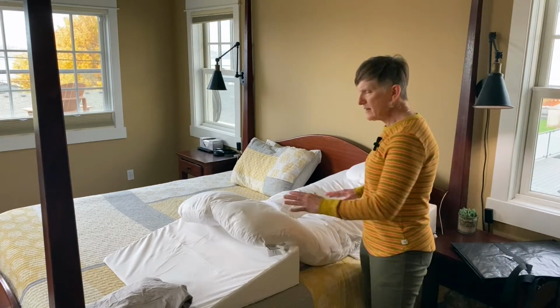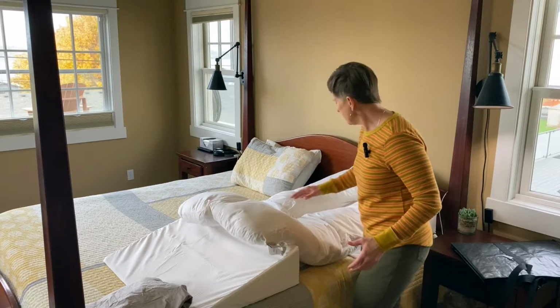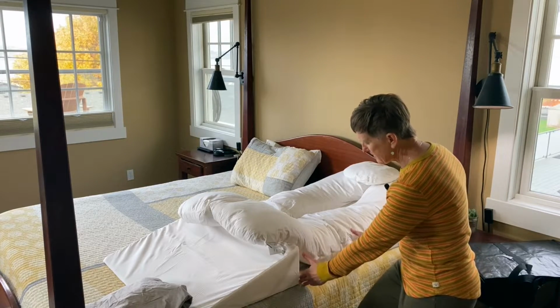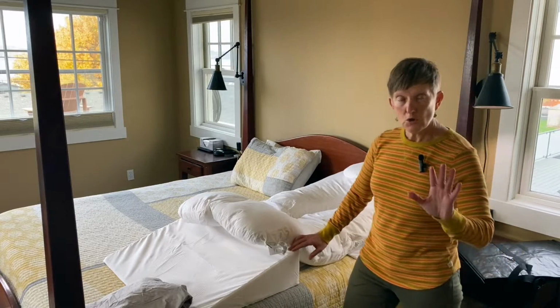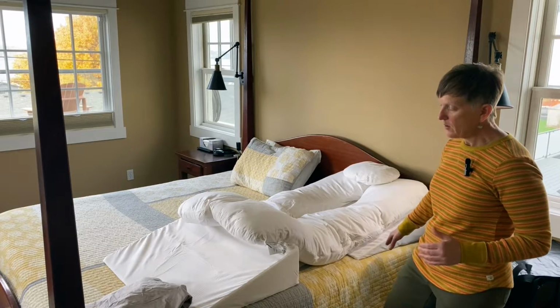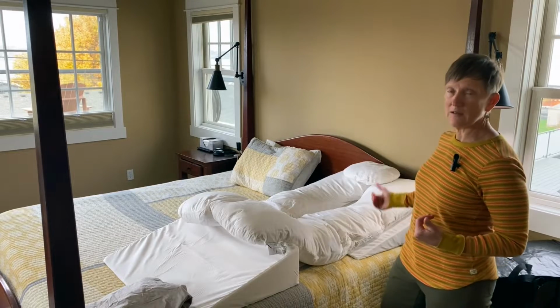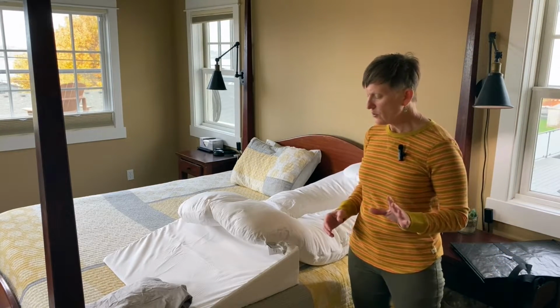The 2 side pillows are designed to be together, so touching at the bottom and touching at the top. And then there should be a space here between the top wedge and the bottom wedge. You can choose to not have a wedge on the bottom. You could only have 1 wedge at the top, or you can take this wedge and double it up and have extra lift at your head. It's what is the best position for you.